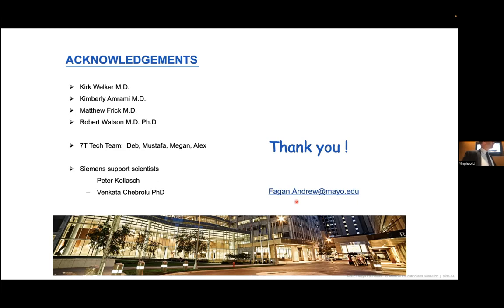So there's another question. I have a question about semi-permanent tattoos, for example, eyeliner. At Martinus Center, they are forbidden at 7T, regardless of their age. Do you have any rationale for it? Yeah, so these tattoos on the eyelids, we don't image those.